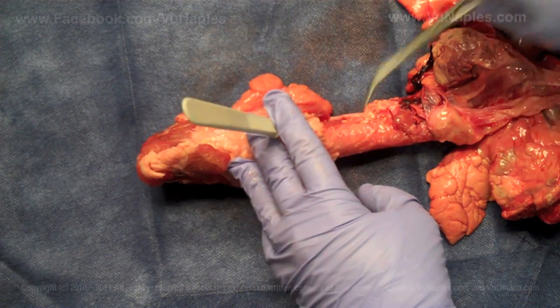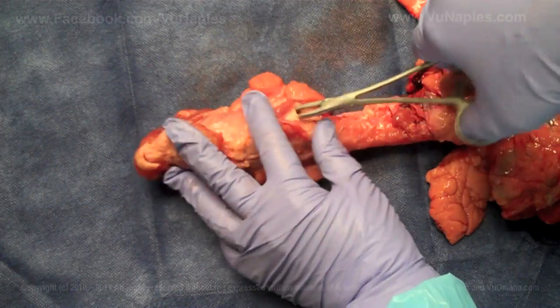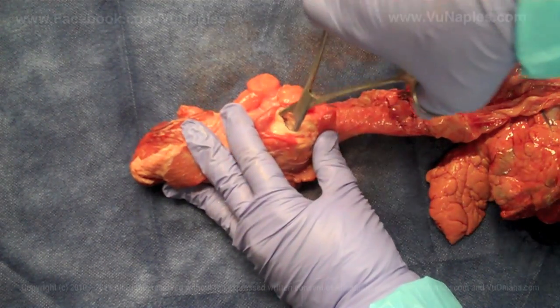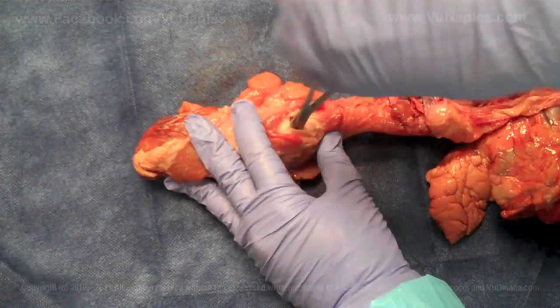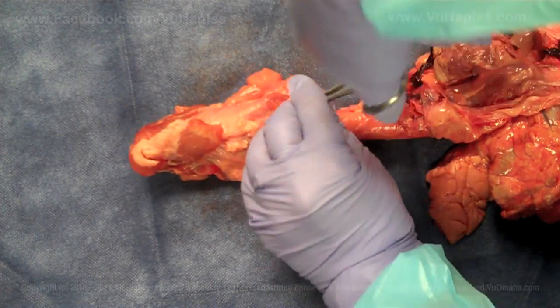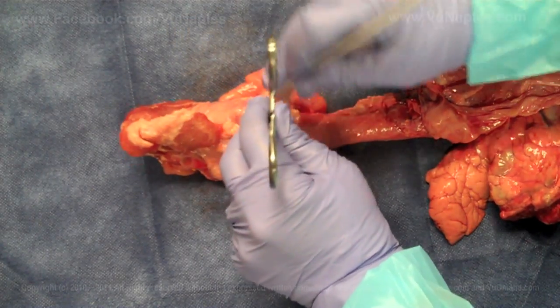You're going to take your hemostats and begin spreading that tissue. With your hemostats in place, you're going to take the tip of your ET tube — a cuffed 6.0 ET tube.